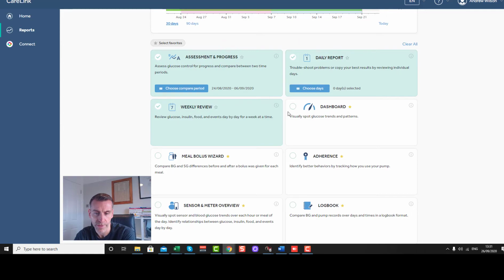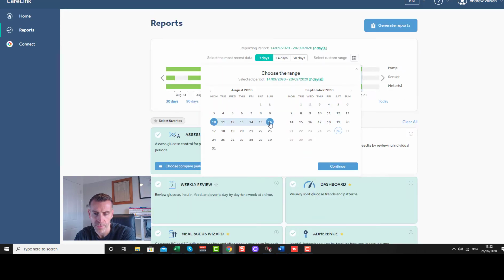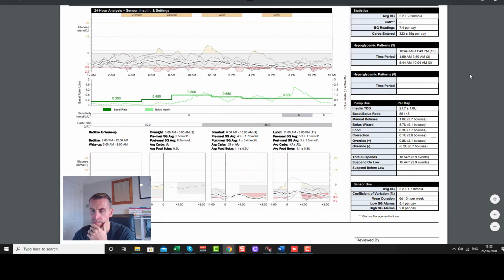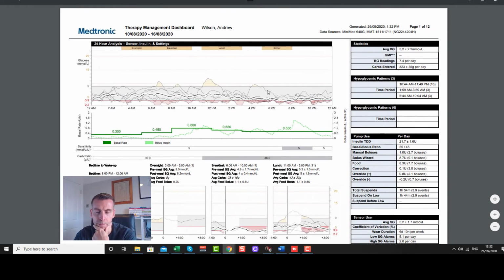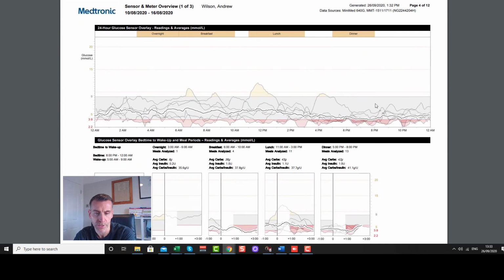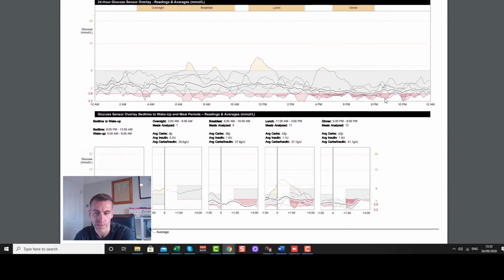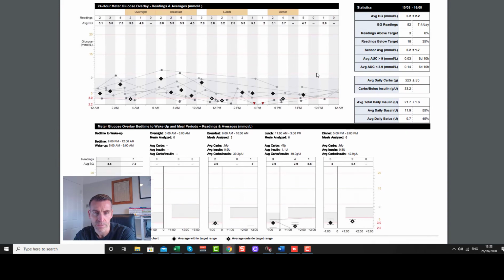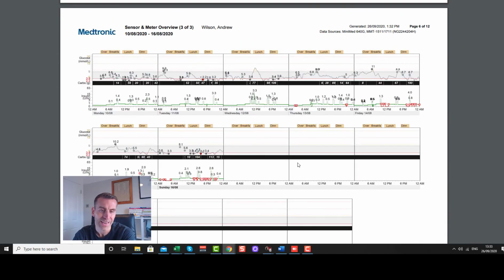Let's click all of it. We'll go 10th to the 16th of August, and you can see here just how much information is on there. And bear in mind, this was only a week, so you've got your full graphs, you've got your average blood glucose, number of blood glucose readings in a day, overview of glucose measurements, overview of where the graphs have gone, seem to be going low quite often. And that is, you can see how complicated this is. I don't think this is very useful for most people.